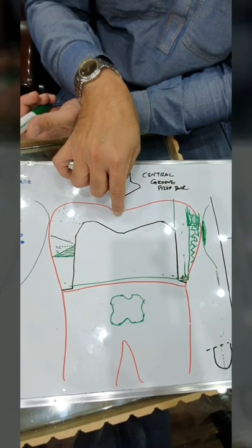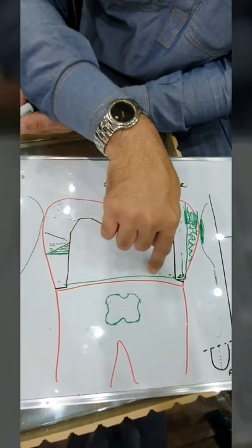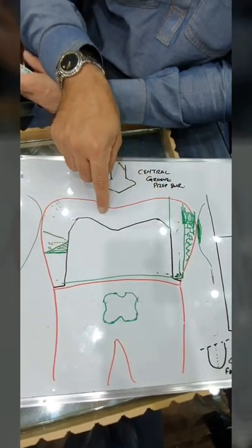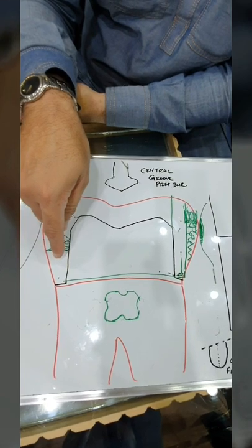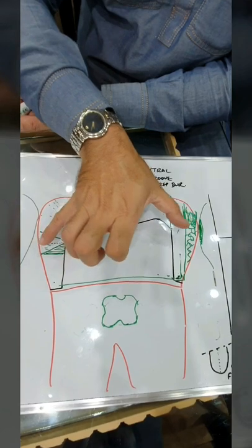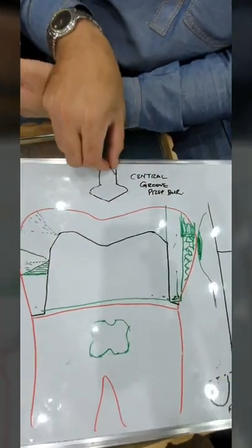I like to do occlusion last. To me it is kind of like building a building. I would have the foundation first, which is the margins. Then I would have the walls as a second thing, and then I would put my occlusion on the walls. So once I have done, like I said, I repeat it, I do the facial and the linguals, then the interproximal, and once the occlusion is left, I would take the central groove and I would take a burr like this.